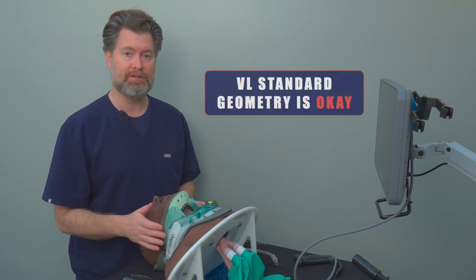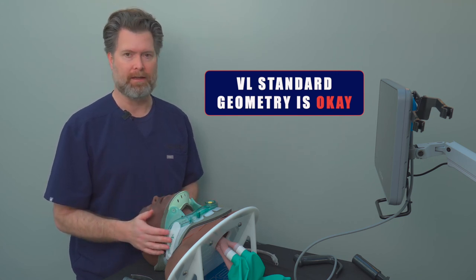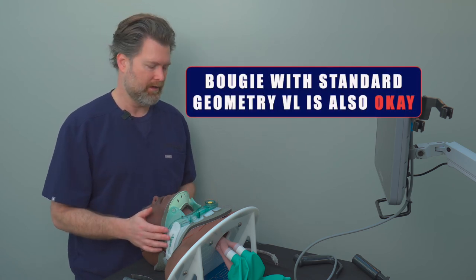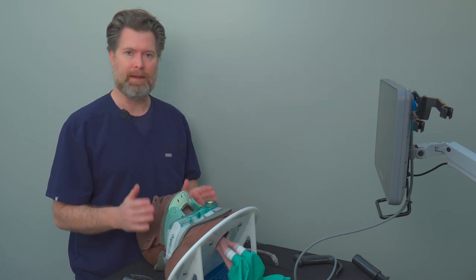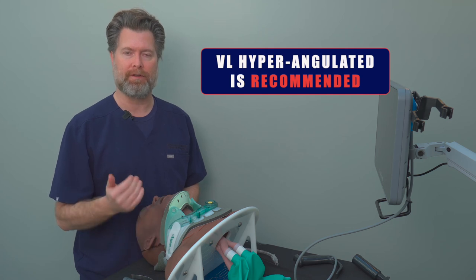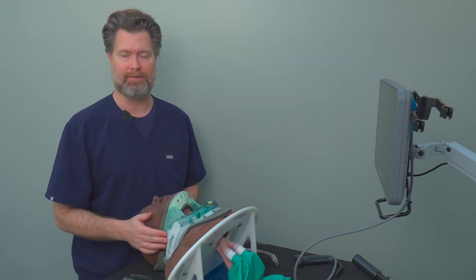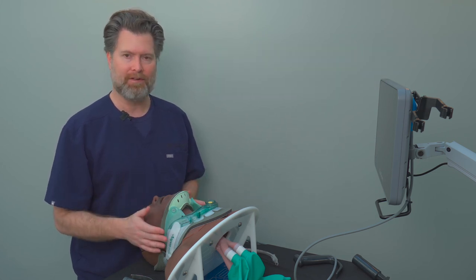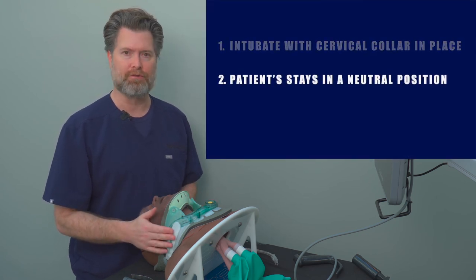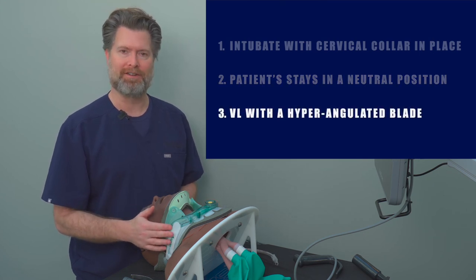For video laryngoscopes: the standard geometry video laryngoscope works well with a regular stylet, and with enough angle on the bougie you can use it effectively too. But the most effective option is the hyperangulated blade, which allows you to get around the primary curve and around the base of the tongue, giving great views of the glottic opening with less force and allowing safe tube delivery. My recommendation: leave the cervical collar in place, keep the patient in neutral position, and use a hyperangulated blade with a rigid stylet to intubate.